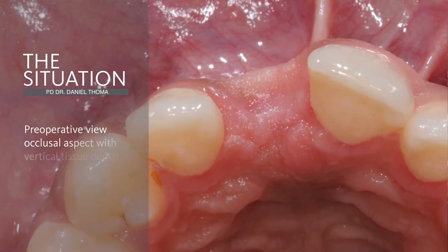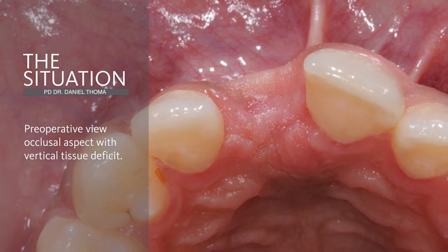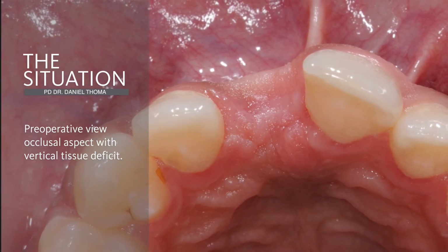Upon clinical examination, severe horizontal and vertical contour deficiencies are present and a decision was made to perform a soft tissue grafting procedure.